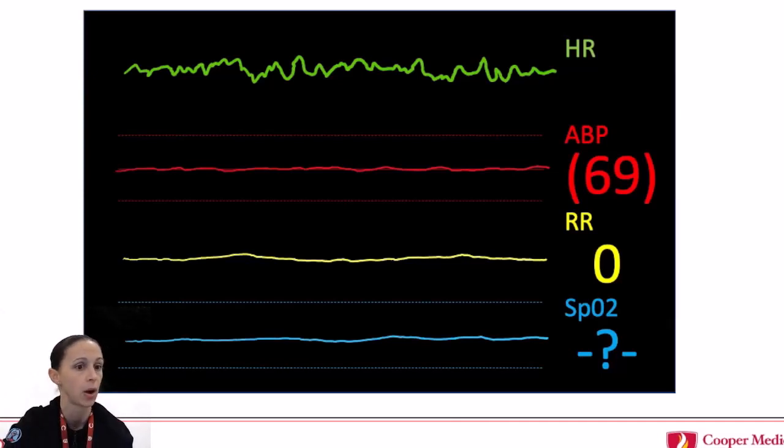Also think about what the causes of VFib are in this patient. If they have other support devices, was there any migration of devices? What's the body temperature is another thing to think about. What are the electrolytes? All those things are relevant when you're trying to figure out the cause. But this is a scenario where you don't do CPR, you have circulatory support, so just dial your RPMs to increase your flow in order to get an adequate mean arterial pressure.